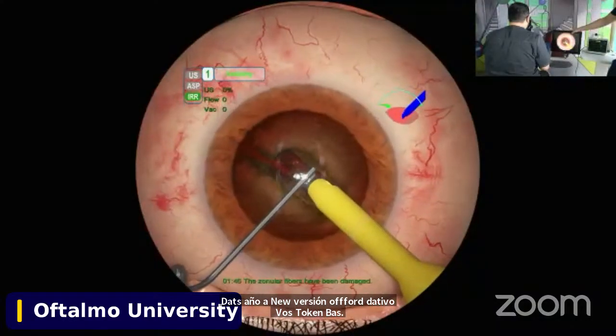So the thing that Oliver was saying, if you see the simulator screen in the upper right corner, you see that handpiece in blue, and you can see how it's moving on the depth of the tip of the phaco. That's a new version of the software that Ivo was talking about. And one other thing, guys, if you focus your attention on the upper right part of the screen, I actually never saw this, but you actually get a 3D side representation of the lens, and see how he's pressing and pushing the lens down. Exactly. Oh, wow, that's so cool. That's new. Yes.